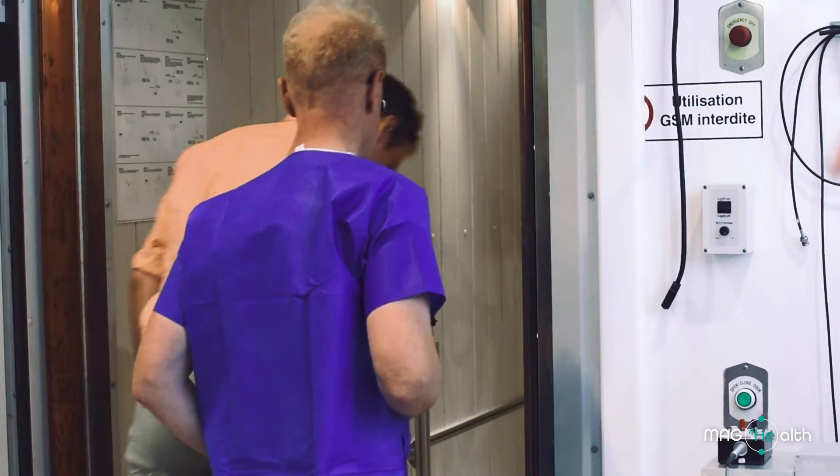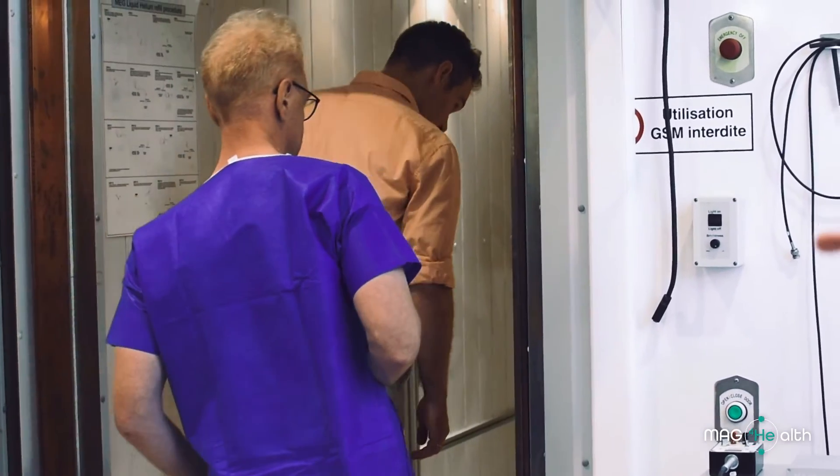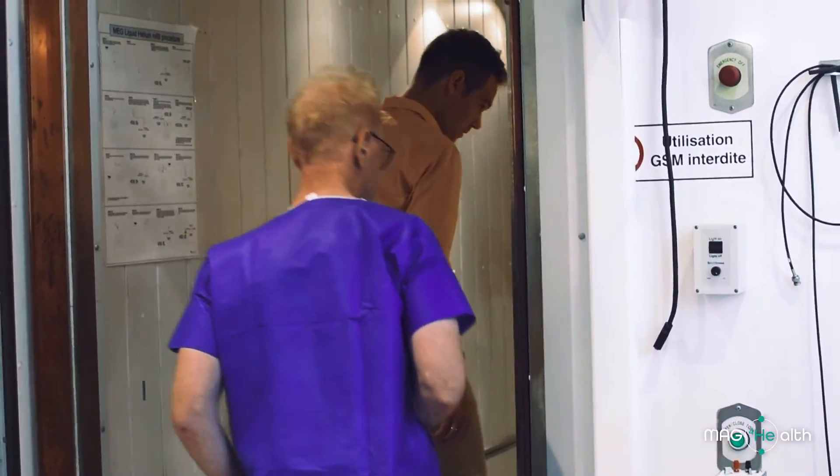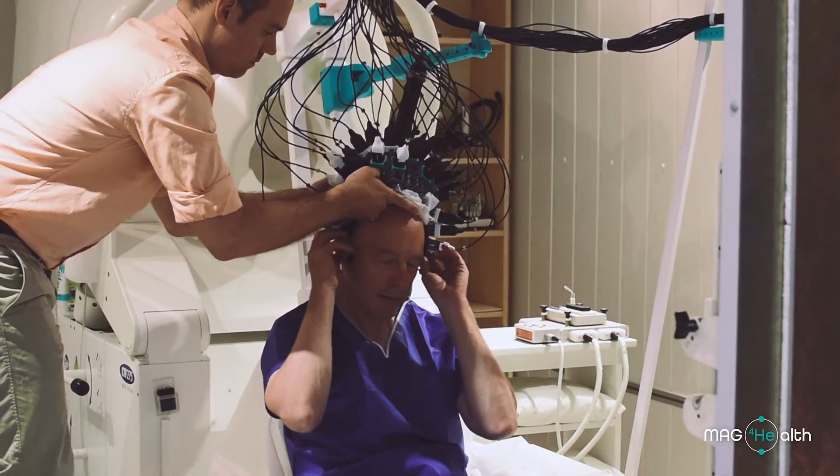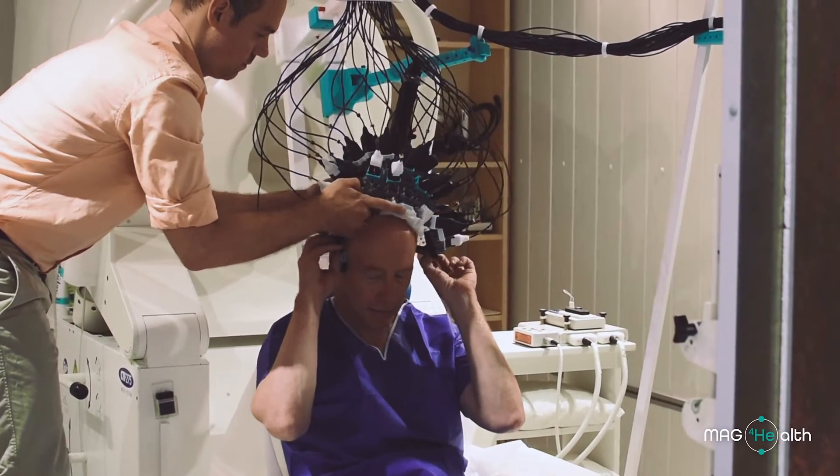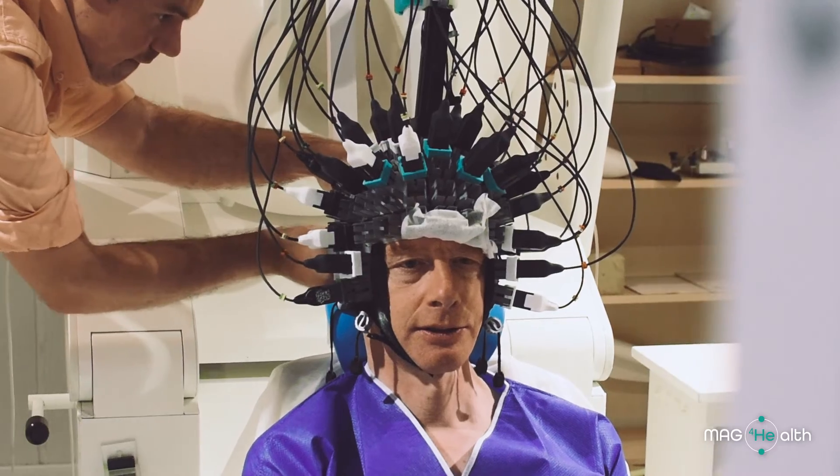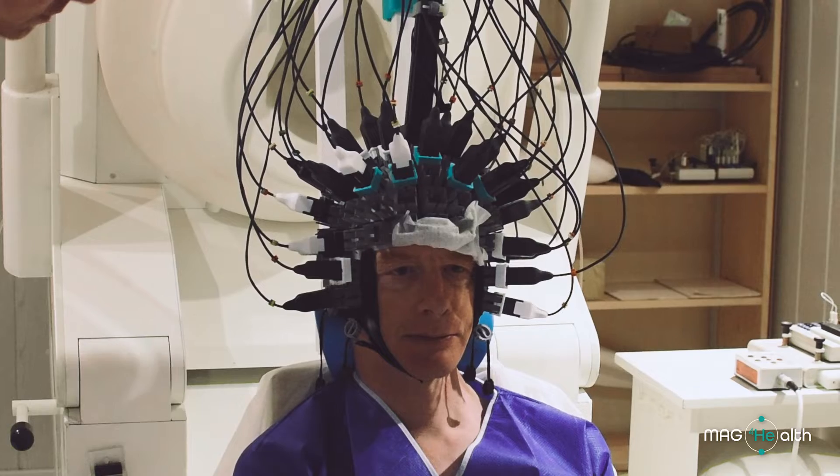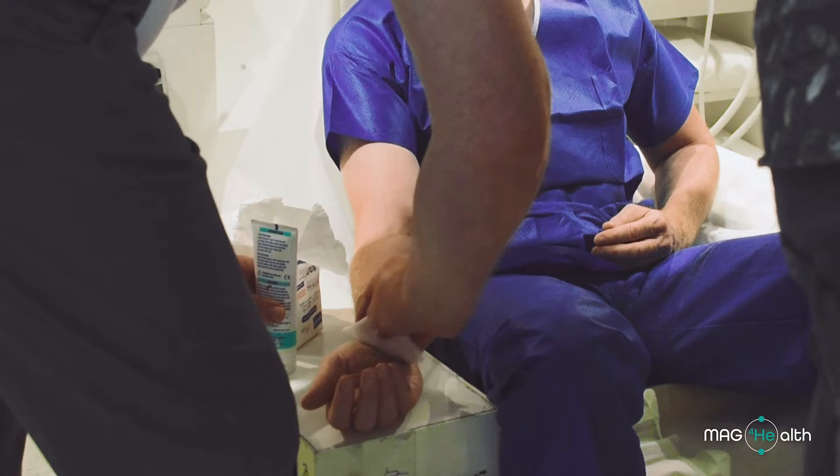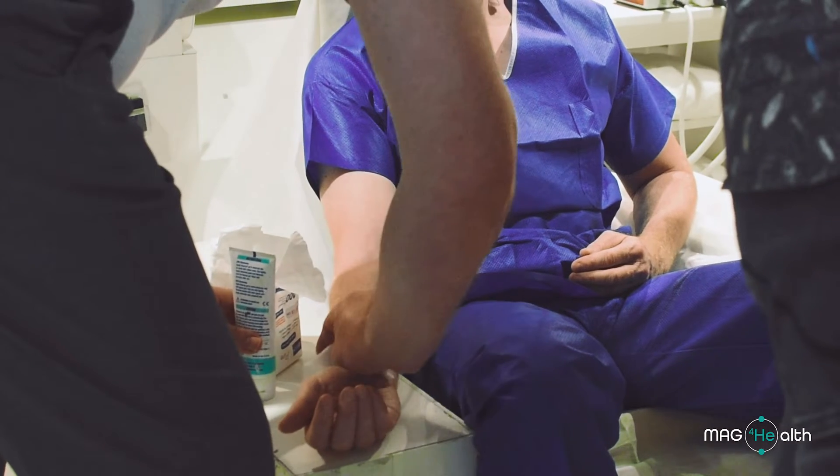This morning and yesterday we did a real live demonstration with a subject. We recorded a subject during a procedure of sensory stimulation of the median nerve.